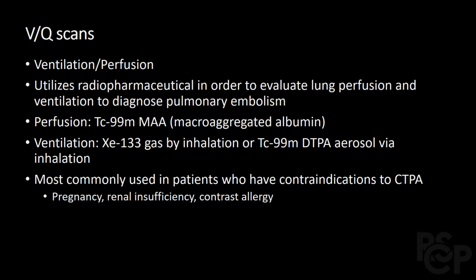VQ scans are commonly utilized in patients who have contraindications to CTPA. For example, if they're pregnant, renal insufficiency, or severe contrast allergies.